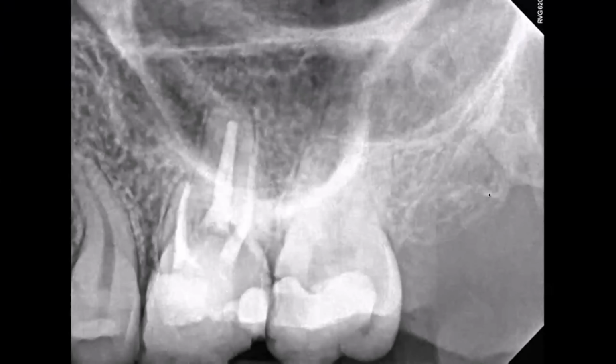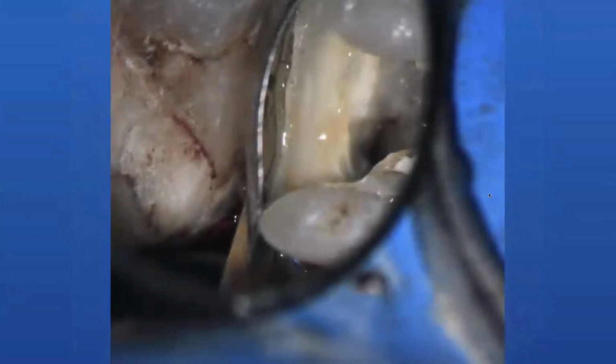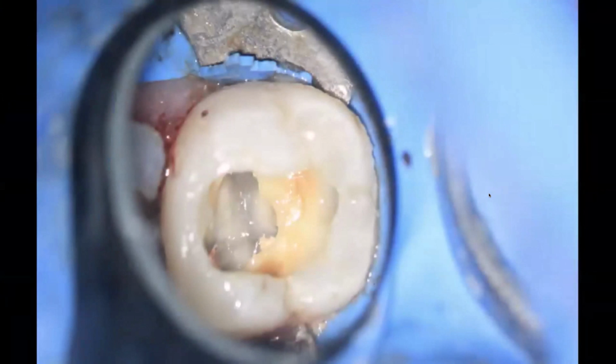Here's another example, a pretty significantly broken down upper second molar. In this case, I was able to fit an actual matrix on the side of the tooth, creating my immediate dentin seal, creating my barrier. So the barrier's done. Now I can proceed as if I was dealing with a class 1 restoration.